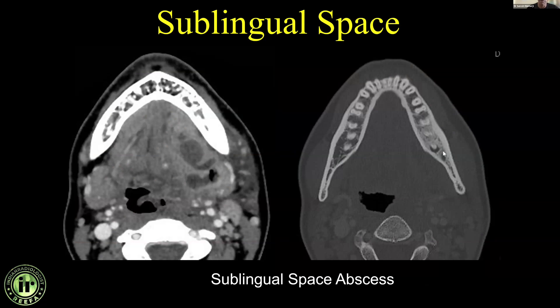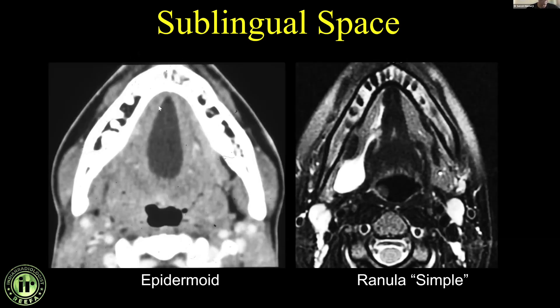When you see a sublingual space abscess, always look at your bone algorithms, because the majority of sublingual space abscesses are odontogenic in origin. In this case, the origin was this rotten tooth. If you look closely, you can also see sclerosis of the mandible, indicating chronic and acute osteomyelitis — resulting not only in this fluid collection, but also a small amount of air within it.